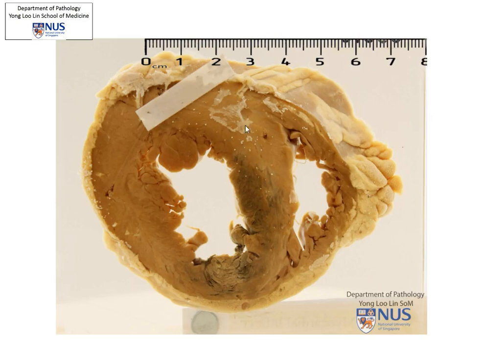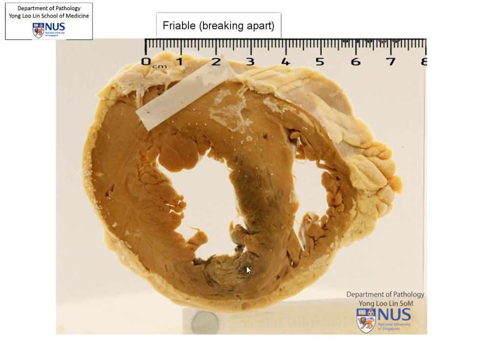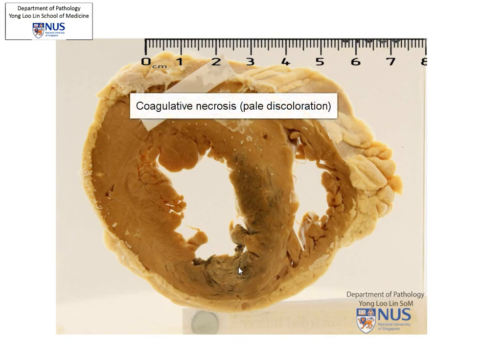This is a specimen of a heart that is transversely sectioned through the left ventricle and the right ventricle. We can see over this area at the antero-septal region of the left ventricle wall that there is this area of pallor. It is irregular, looks a little bit friable — meaning it's crumbling a little bit — and there are some foci of darker, blackish hemorrhage within this region. This is a classical appearance of coagulative necrosis.